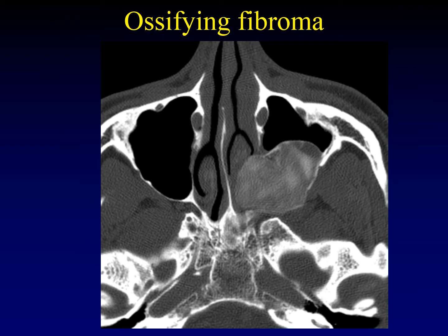At first glance, this looks a lot like fibrous dysplasia. There is ground glass opacity and it's well-defined, very benign looking. But remember what we said about the configuration of fibrous dysplasia — it has the configuration of the underlying bone. This is lobular, spherical, and that is characteristic of an ossifying fibroma. This is how we distinguish between fibrous dysplasia and ossifying fibromas.